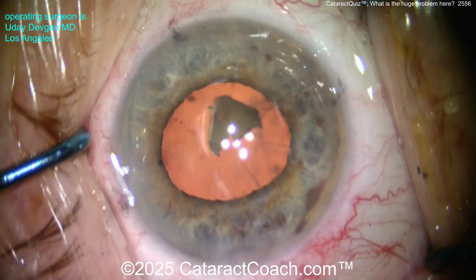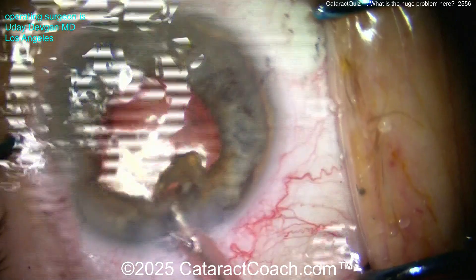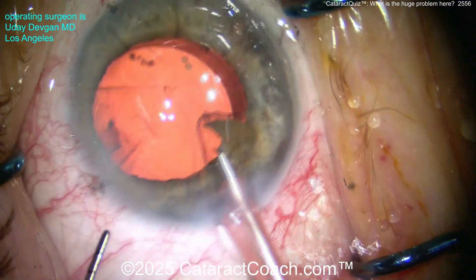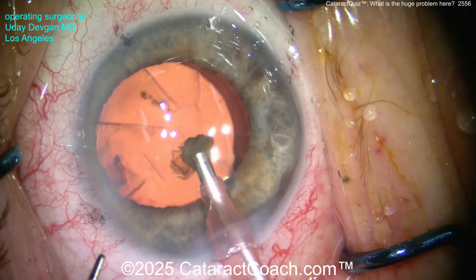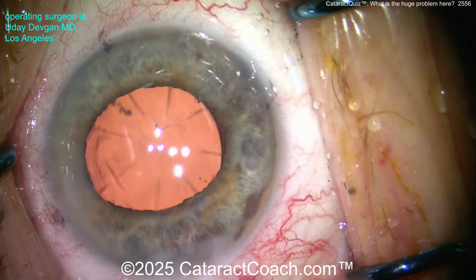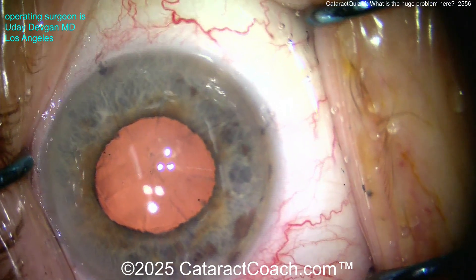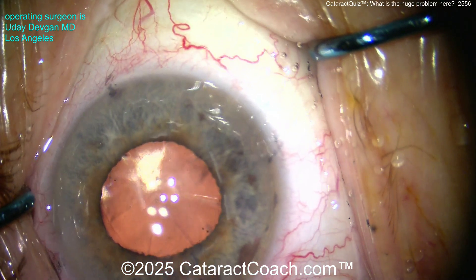You could miss this, finish up the case, and be sad — because then you'd see it at the slit lamp and it's not going to dissolve away. So I have to go back with the phaco probe to get rid of that last chunk. I watched the video and I could not tell when that piece went under the iris.